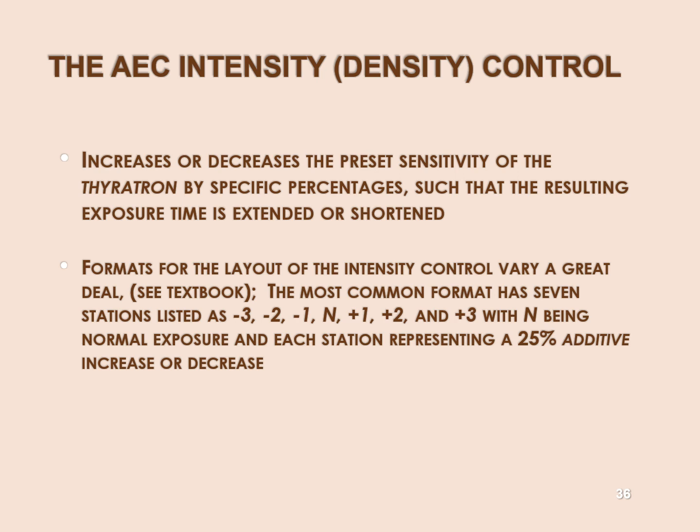And you can do that with manual technique too. Automatic rescaling software, anytime you're overexposing more than what the manufacturer recommends, the software subroutine called automatic rescaling is rolling back your exposure values to a fraction of what they were. Okay? But the patient still gets 2 and 3 times the dose. So, the software is great. It's making you guys look like Rembrandt.